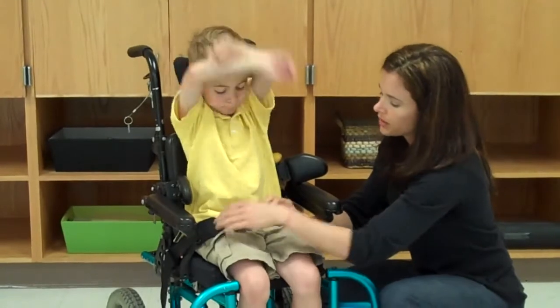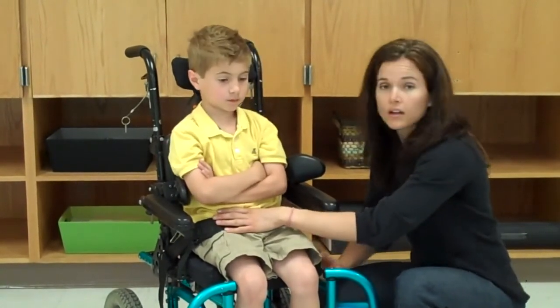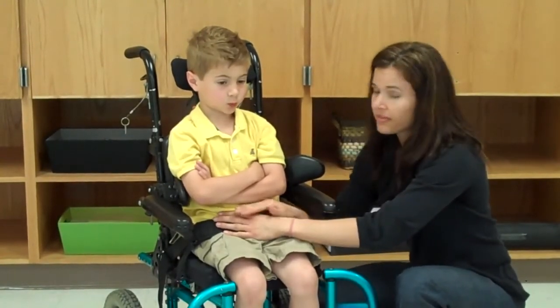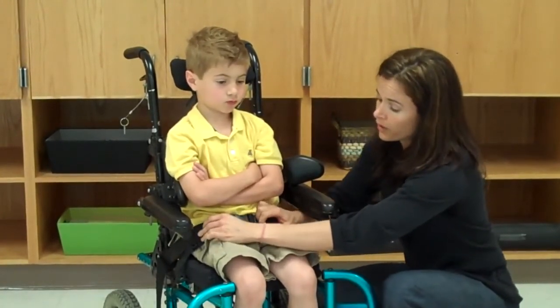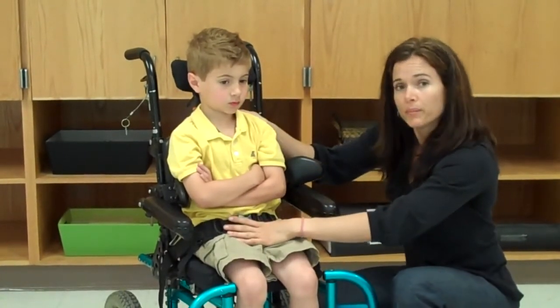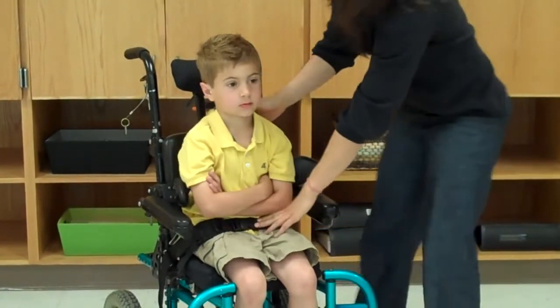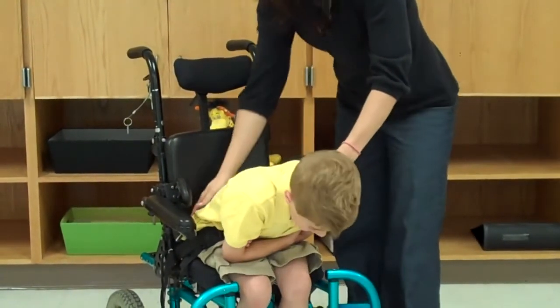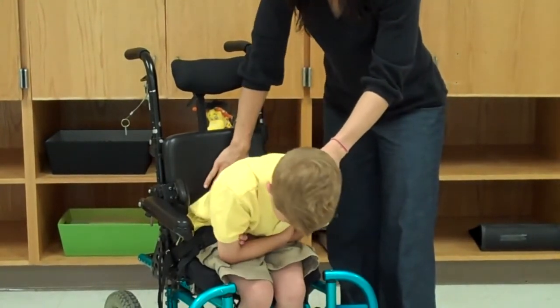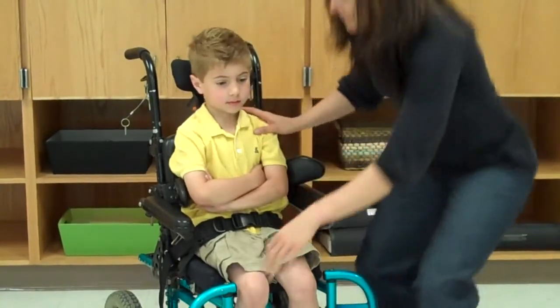Once it's secured, you can see if his pelvis is level by putting your hand across his hips. Once you've noticed that there's no rotation and they're level, you can tighten the pelvic positioning strap. At this point too, you want to make sure that his hips are all the way back in his seat. We do this by leaning him forward and checking to see if his hips are making contact with the wheelchair back. Okay, let's sit on up.